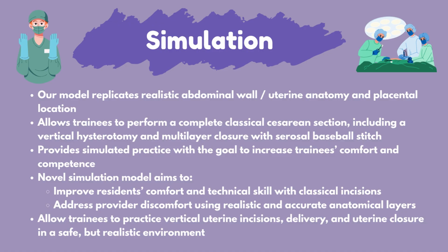This novel simulation model aims to improve residents' comfort and technical skills with classical incisions, address provider discomfort by offering realistic and accurate anatomical layers, and allow trainees to practice incision, delivery, and closure in a safe but realistic environment.